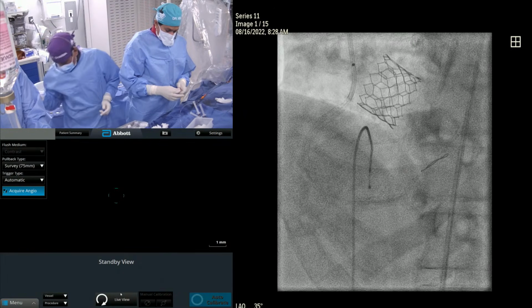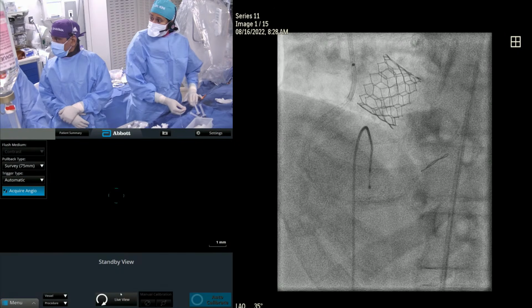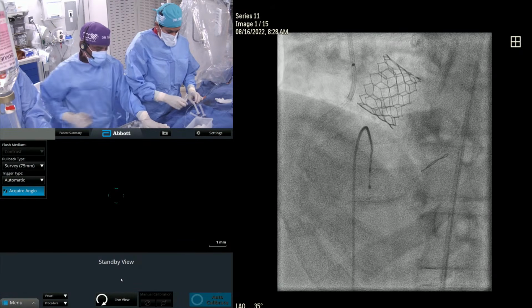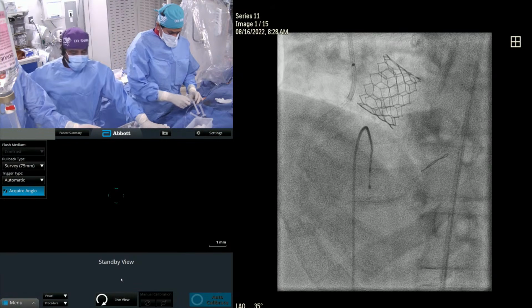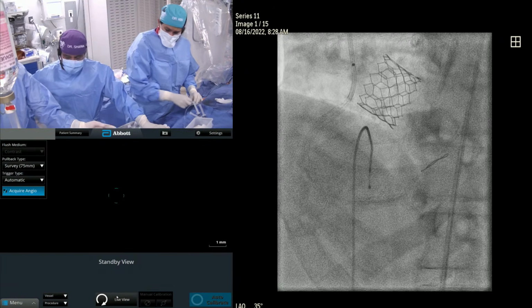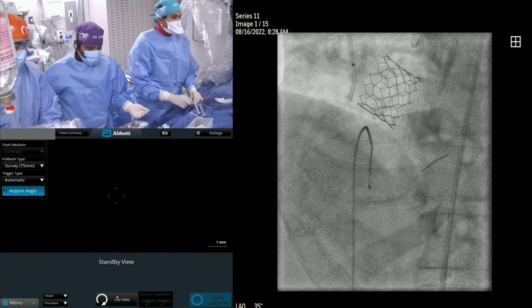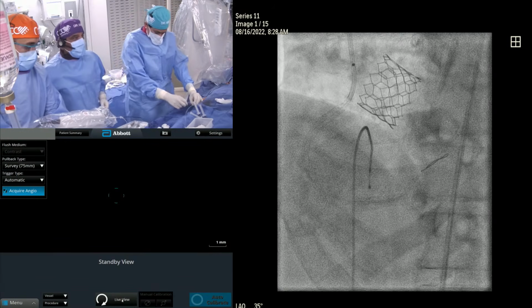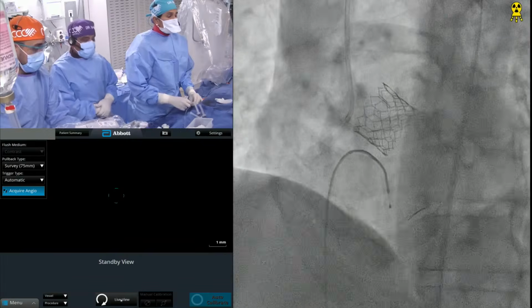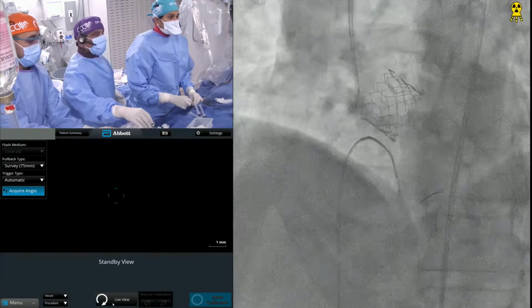Behind the underexpanded stent, a lot of fibrous plaque, looks like not calcium, but a lot of plaque burden behind the stent. So they're also saying that there is a plaque burden behind the stent struts. And remember the earlier data have shown anytime plaque we left behind the stent struts correlate with subsequent restenosis. So therefore this patient did have a plaque at that time. When we did rotablation plus stent last year, that may have contributed, but more importantly, contribution occurred because the stent got deformed at the time of the balloon expandable Sapien deployment.